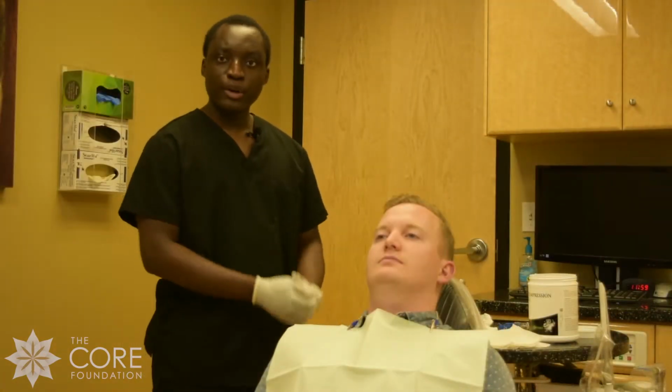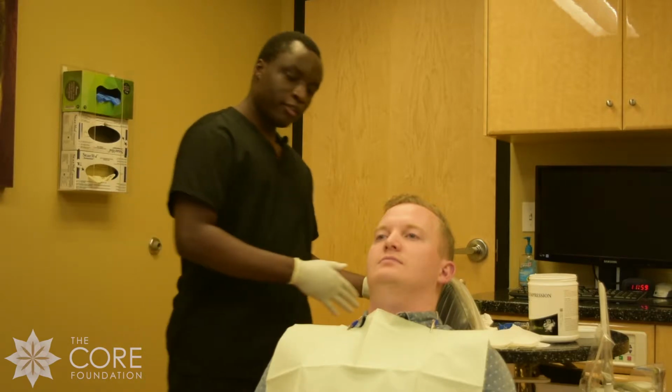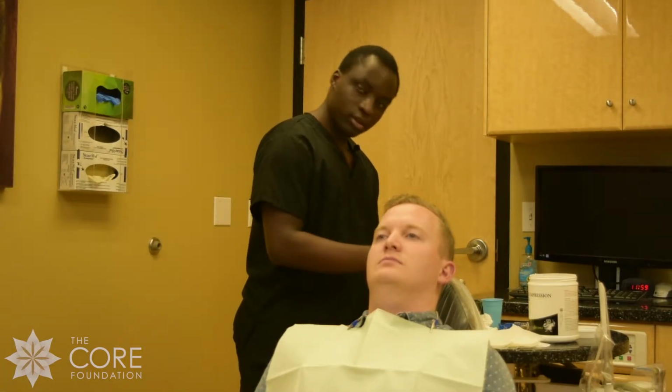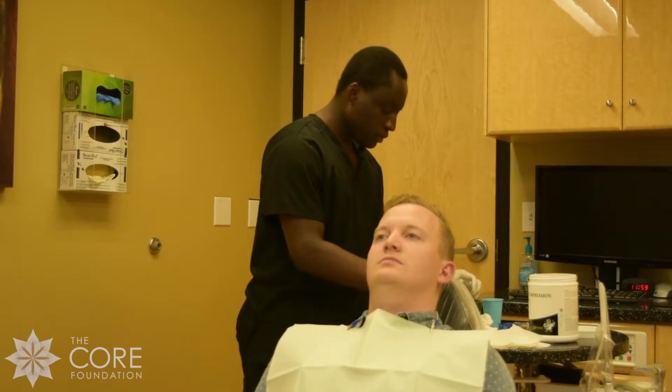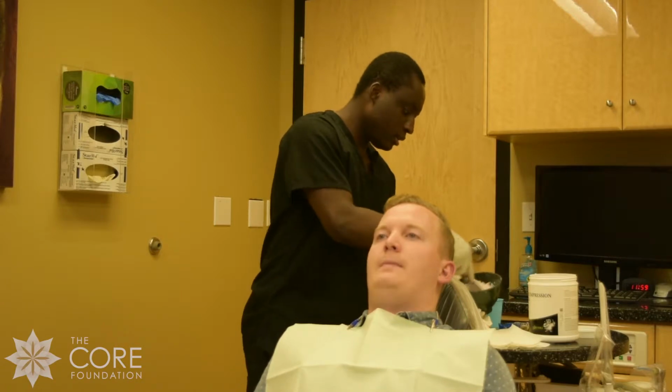All right, so we're going to retake the impressions, this time using different techniques. I've already measured out the alginate for the top and also have the water ready. So I'm going to pour it up, quickly get it mixed and get going on the impressions.